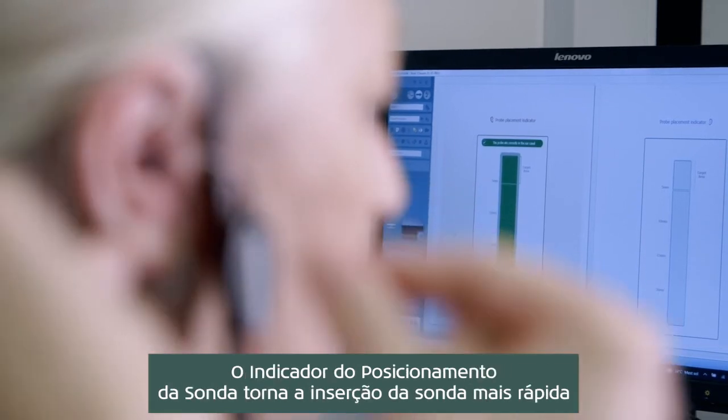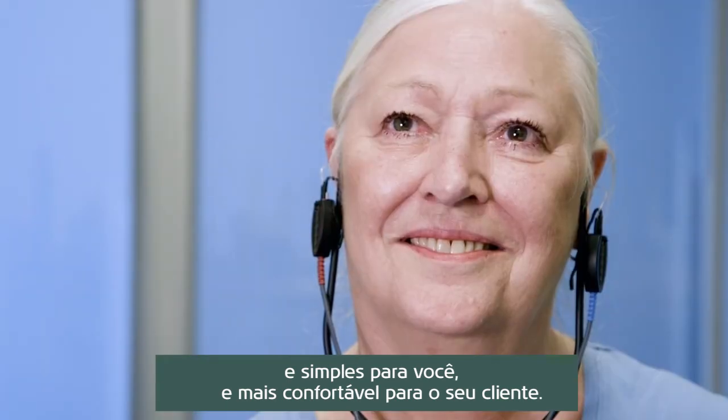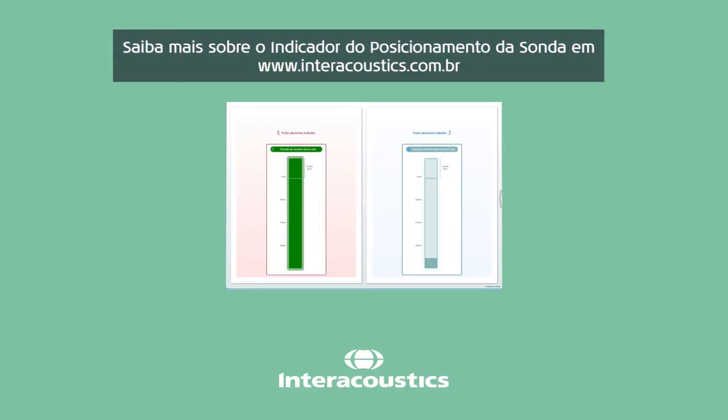The probe placement indicator makes probe insertion faster and easier for you and more comfortable for your client. Learn more about the probe placement indicator at www.interacoustics.com.